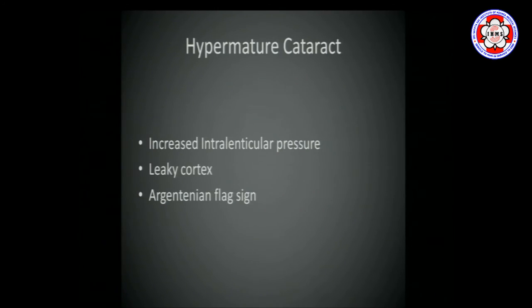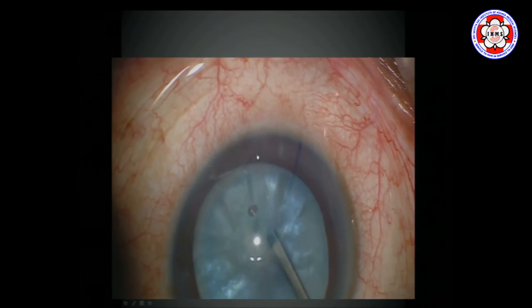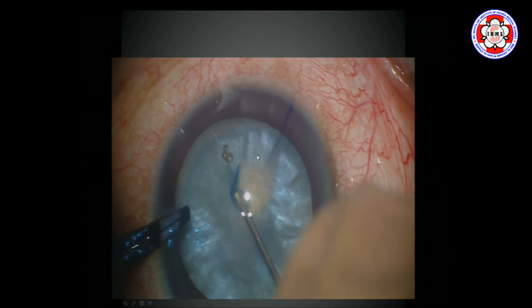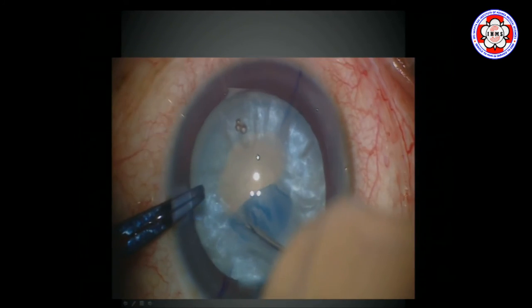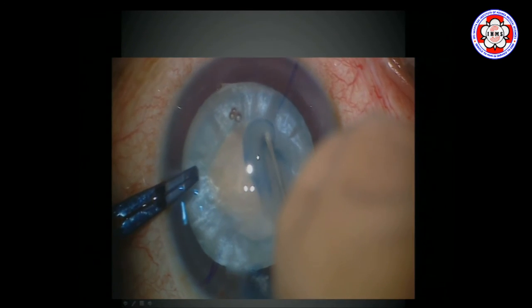You always come across situations with increased intralenticular pressure — hypermature cataract, liquefied cortex, semi-liquefied cortex. The moment you touch it, you get the Argentinian flag sign. To avoid that: make a small nick where you start — it begins to leak out, then stop. Put in your hydrodissection cannula, aspirate the cortex, go into that small nick, and decompress by pressing down and aspirating from inside the capsular bag. Then refill the anterior chamber and start again. You'll have reasonably good control because the intralenticular pressure has been brought down.